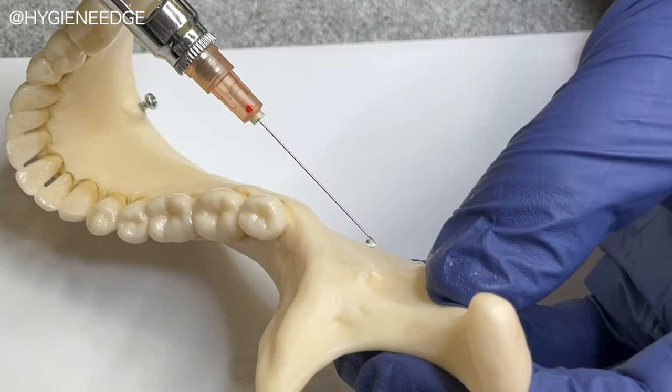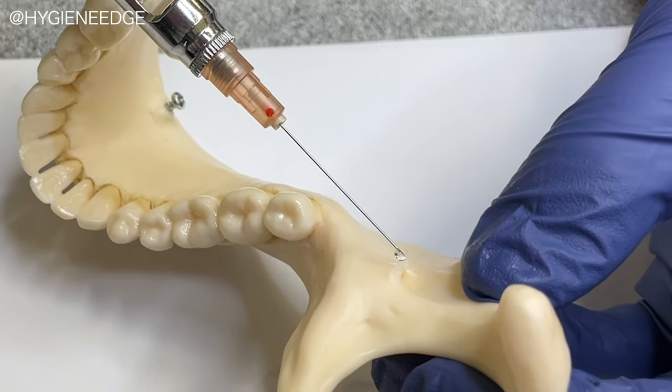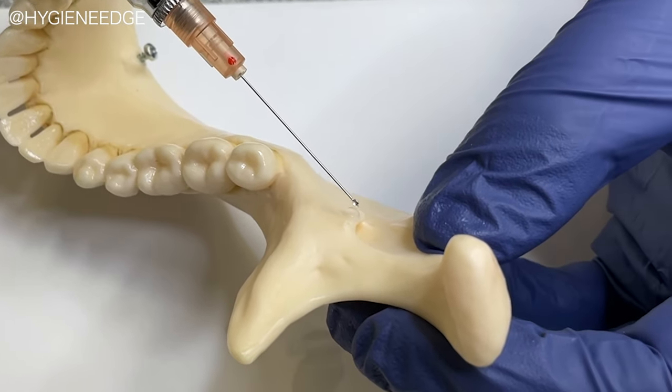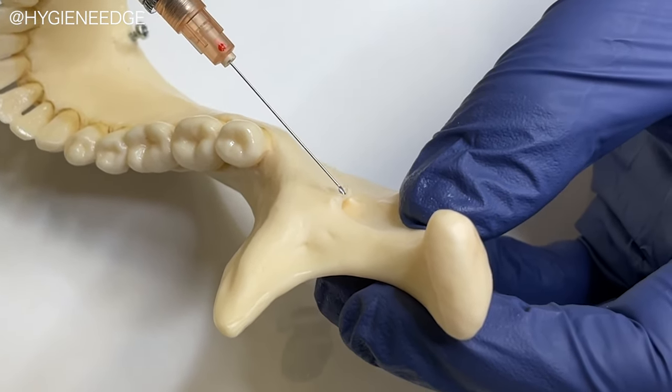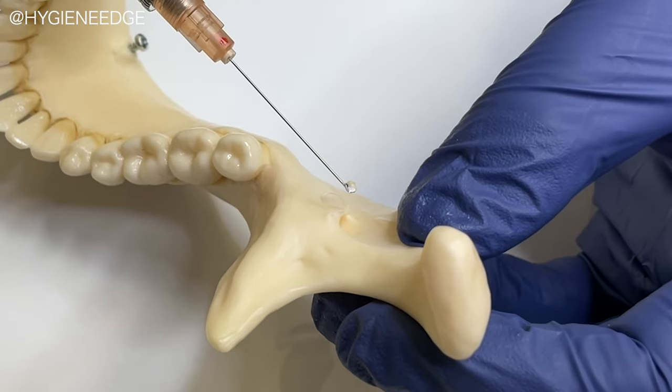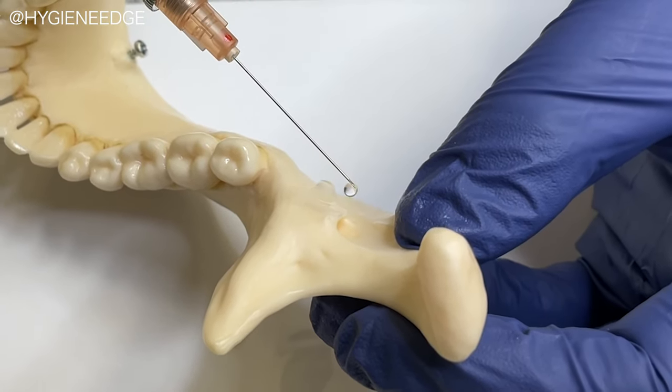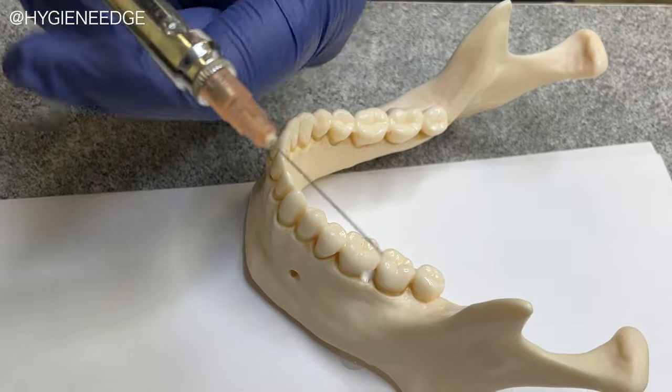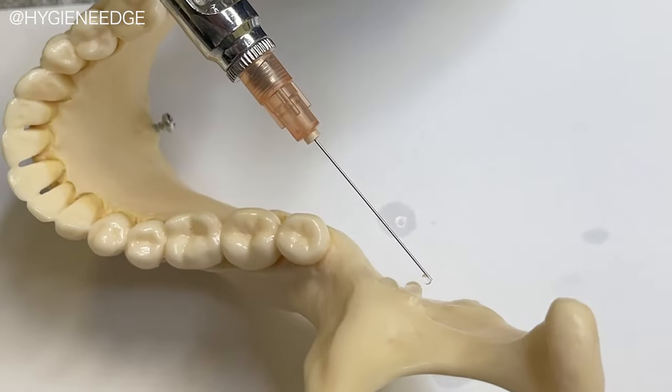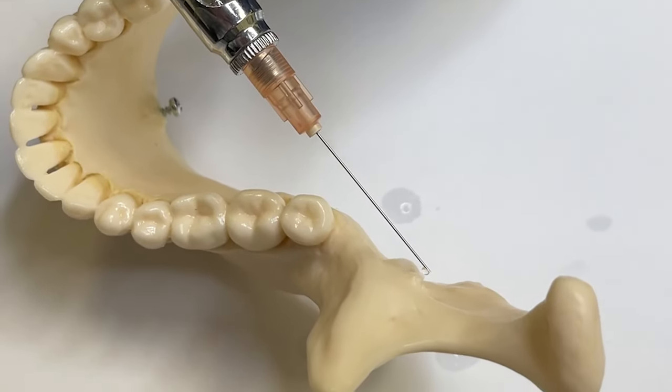So as I give an injection, you want the bevel towards the bone. So if I look right here and I can see that red dot, the bevel is going to be away from the bone. And when I dispense, the liquid's going to be going away from that foramen. But if I do bevel towards the bone, now it's going to dispense towards the foramen. So good. Thank you.